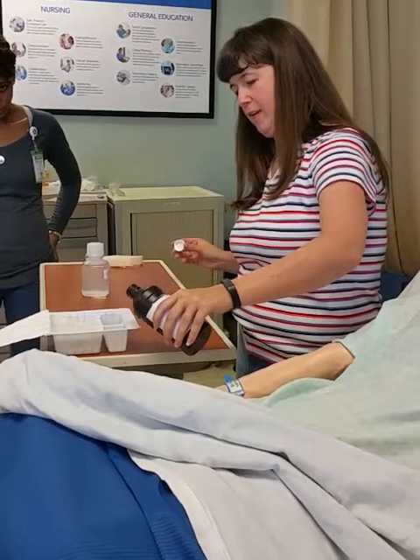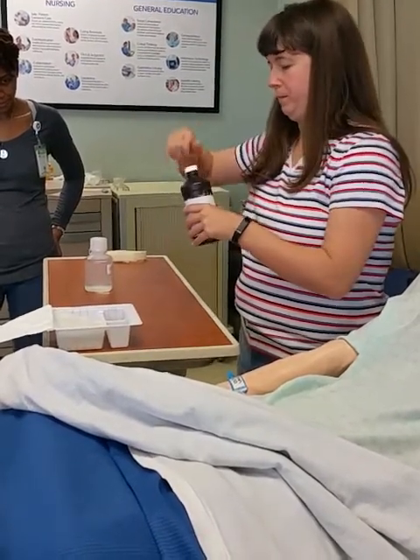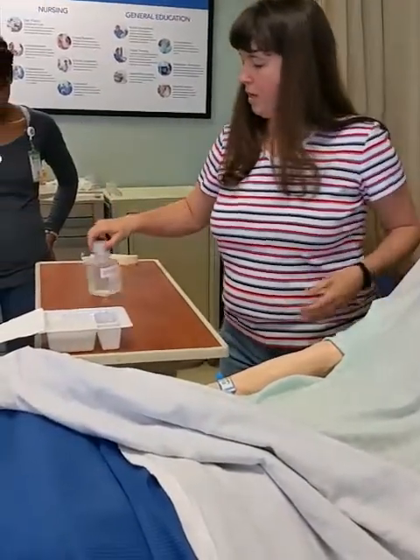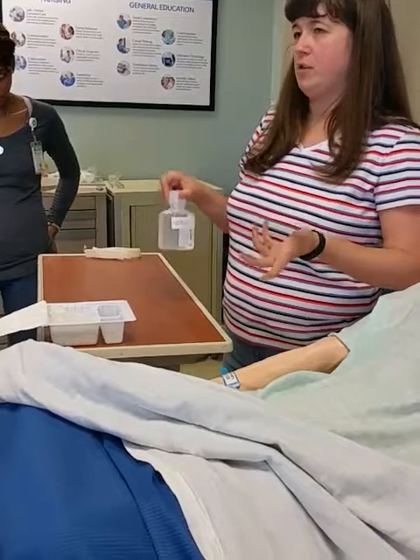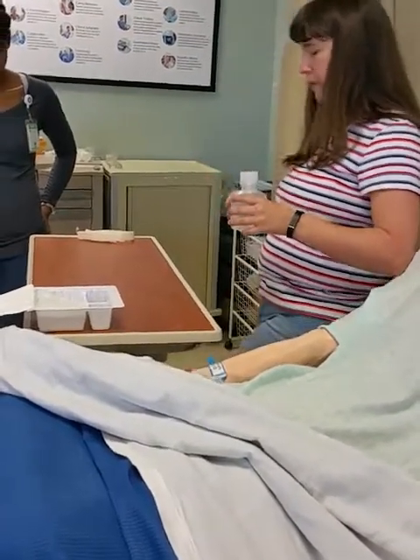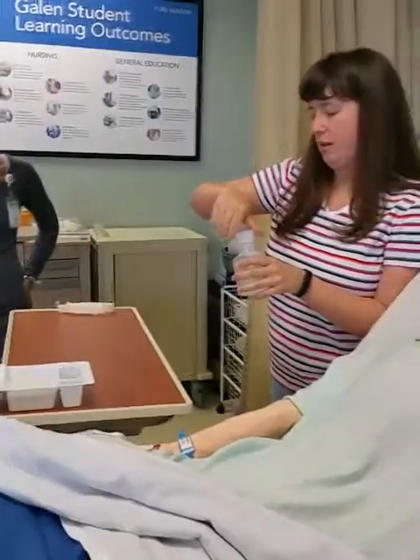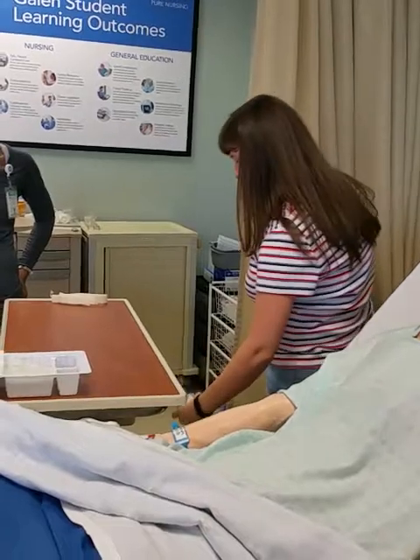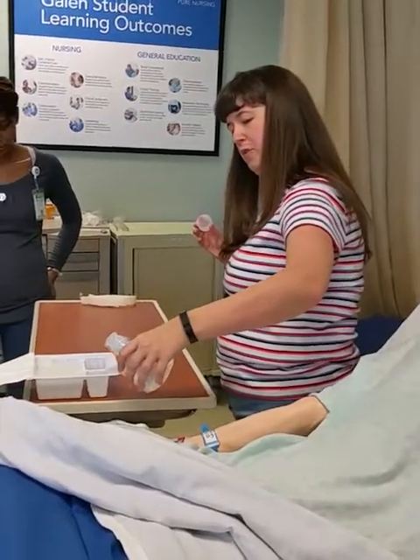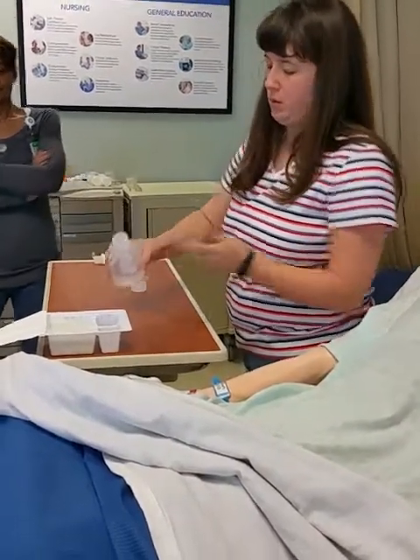And I'm going to pour half hydrogen peroxide. Now, I opened this bottle to do suction, so it's now no longer a new bottle. So what I have to do is I have to lip it to rinse the edge of anything that might be there. Okay. So I'm going to fill the other half. And then I'm going to switch hands.